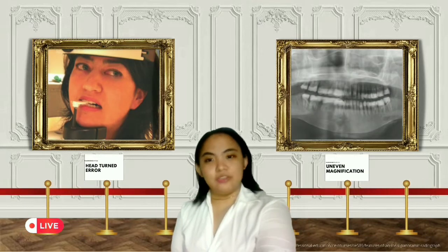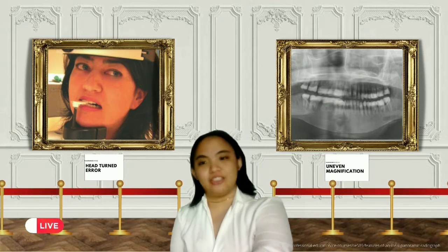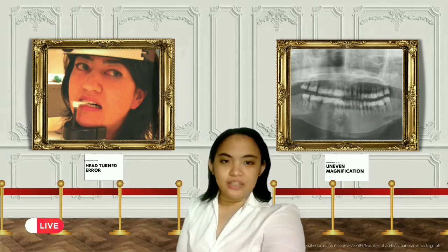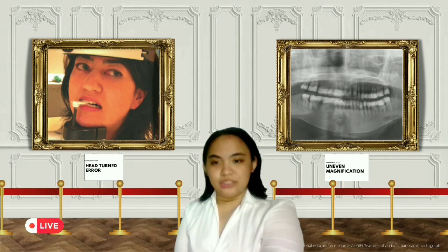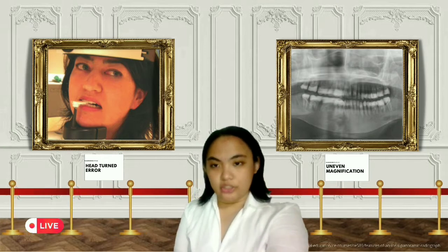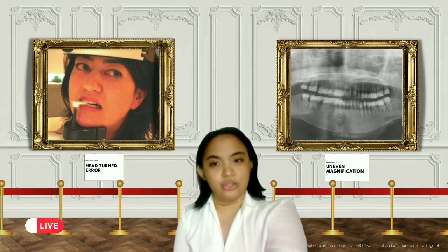Now, let's go on to the next piece. This is called the head turn. It is part of the mid-sagittal plane errors, the horizontal kind. If the patient's head is turned slightly to one side and not centered on the bite block, as you see here in this image, the structures on one side are closer to the receptor while the structures on the other side are further away. As a result, the ramus and the posterior teeth on one side of the image appear larger than those on the other side of the image.